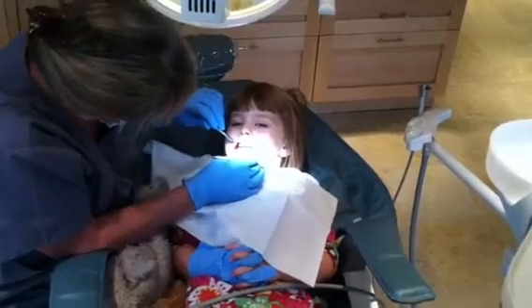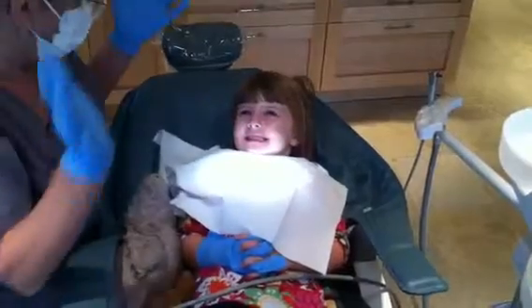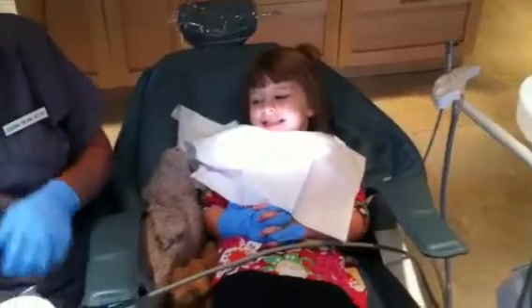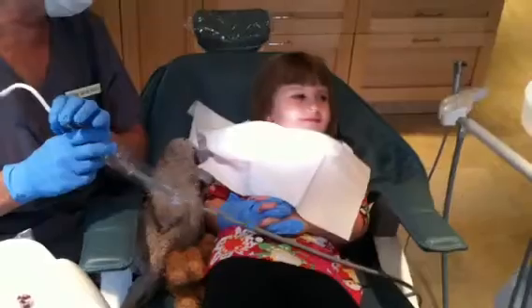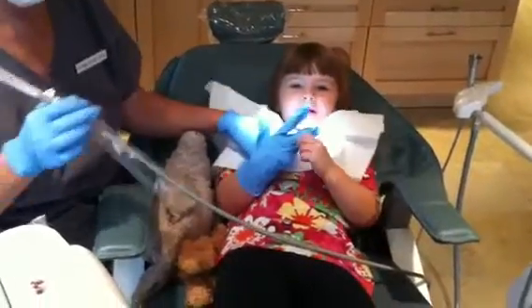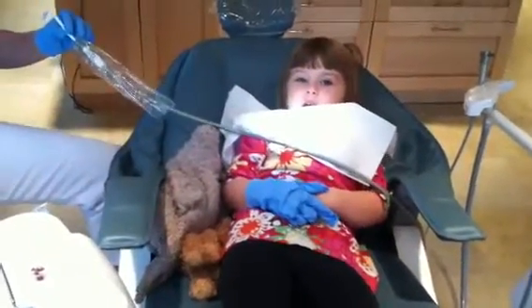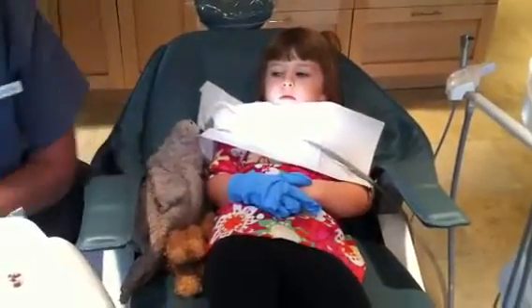Can you bite your teeth together? Oh, that's perfect. You have beautiful teeth and a beautiful smile. You need to make sure you take care of them — brush your teeth. You brush your teeth a couple times a day? Does mommy help or do you do it by yourself? I do it and then she does it. What toothpaste do you use? Bubble gum — it's like an Oral-B. It's better to use a kid's taste toothpaste.